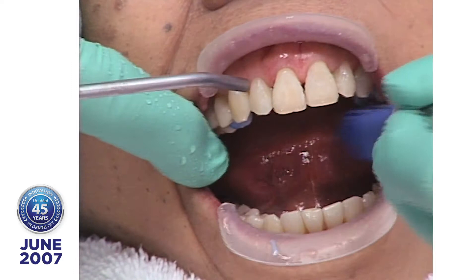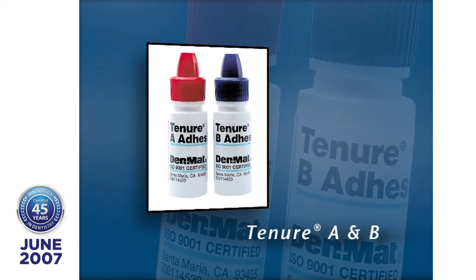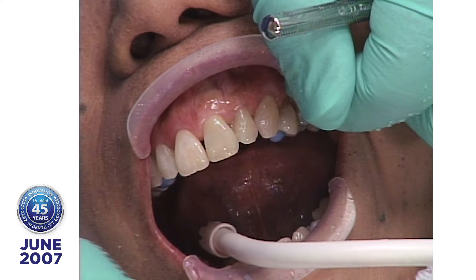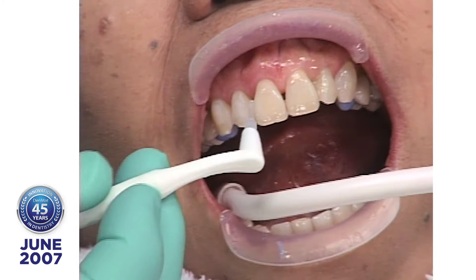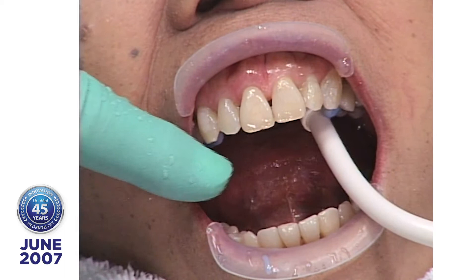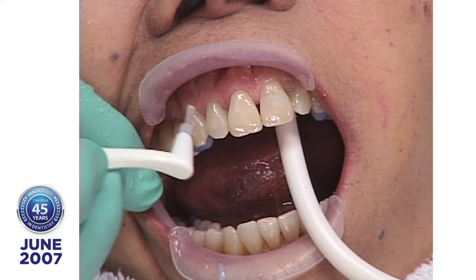Now I'm applying a solution of Tenure A+B. Tenure A+B was developed by a dentist by the name of Ray Bowen. Ray Bowen developed composites, the air rotor, and a whole bunch of things in dentistry. There's not a better dentin bonding system around than the one Ray Bowen developed. He came to me at a convention in Atlanta, an ADA meeting, and said, Bob, I got this fantastic dentin bonding system — but I can't get anybody to use it because it has nine steps. So we took out a license with the ADA, got our chemists working on it, and got it down to two bottles, one solution, and one step.